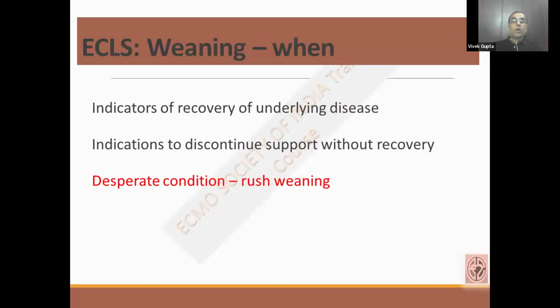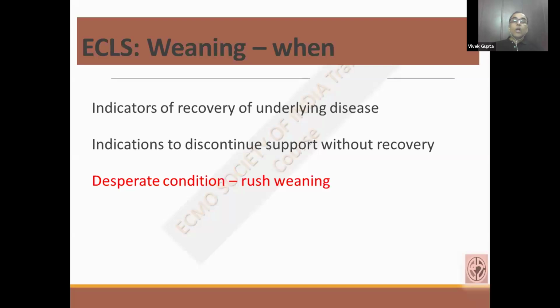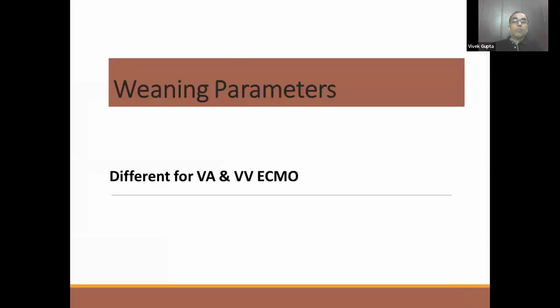And here we can always do discontinuation of therapy after consultation and counseling of the patient's relatives. Or sometimes you need to do a rush weaning in cases of desperate situations, like when a patient is bleeding massively and there is a chance that if you discontinue ECMO, the patient may improve.